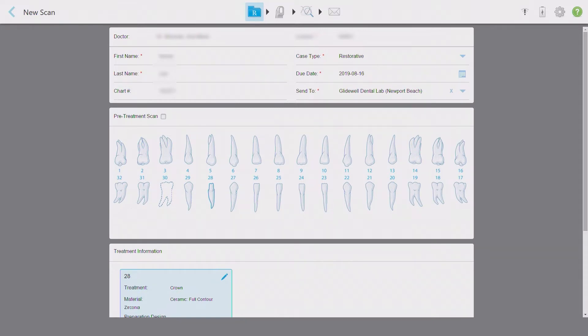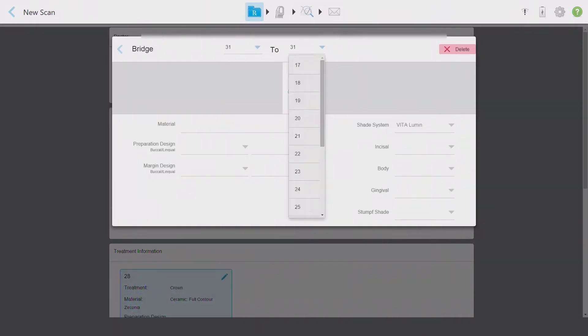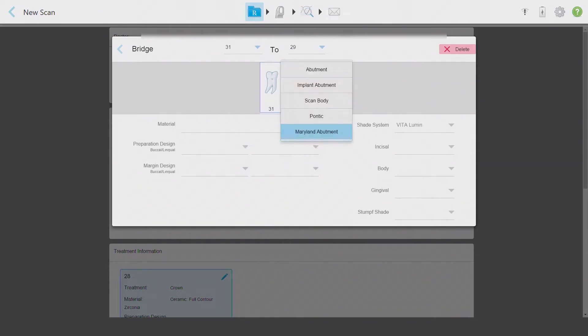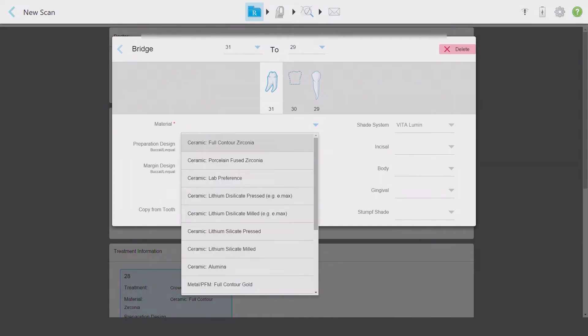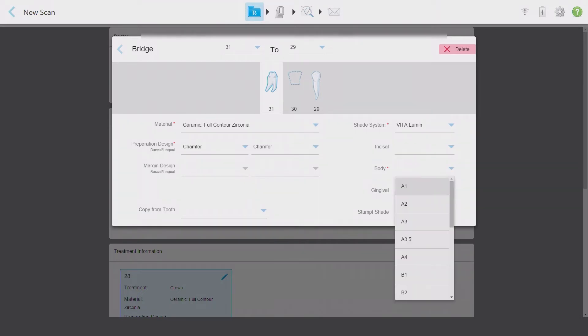Now I'll go back and start the data entry for the bridge. I can select either of the bridge abutments — here I've chosen number 31 — and then mark it as a bridge. Don't worry about selecting the additional bridge retainers yet. A drop-down menu will automatically open and provide you the opportunity to select the remaining retainer. I'll select tooth number 29, and my bridge is shown in the view box. I can now choose each individual unit in the bridge and mark them as abutments or as pontics. To make things easier while entering specific design features, I'll first enter all of tooth number 31's information manually. I include the required information such as prep design and shade, but also details such as the stump shade.